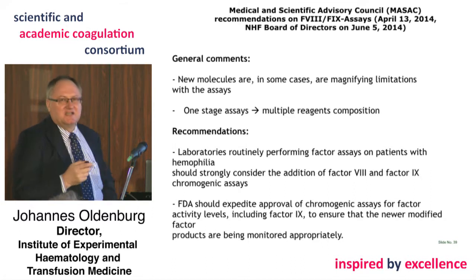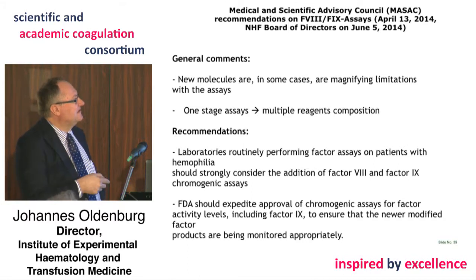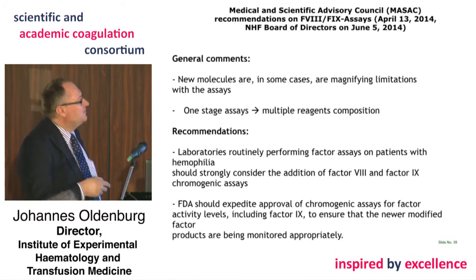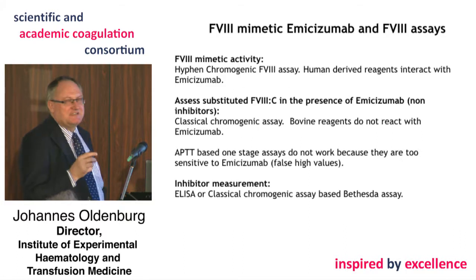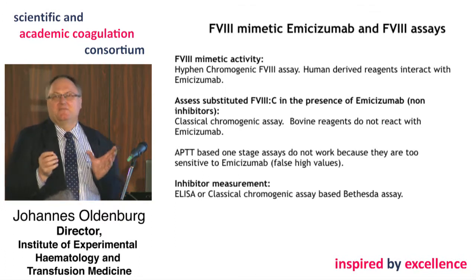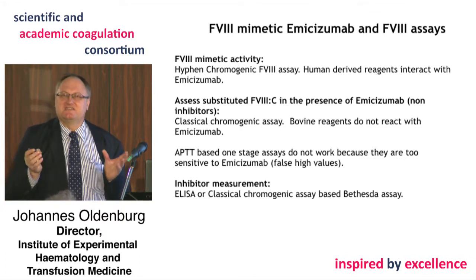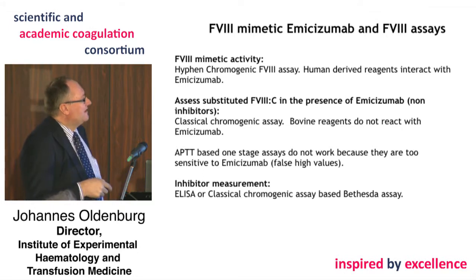At last, I would like to show the complexity with respect to a factor VIII mimetic molecule. This is emicizumab. If you go for measuring the factor VIII mimetic activity, you can only do this by using the chromogenic assay from Hyphen, because only human-derived reagents interact with this bispecific antibody.